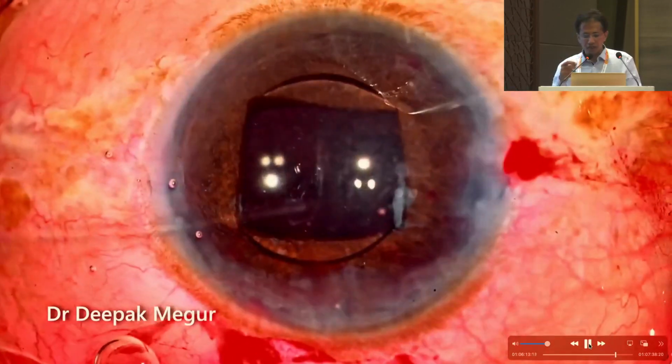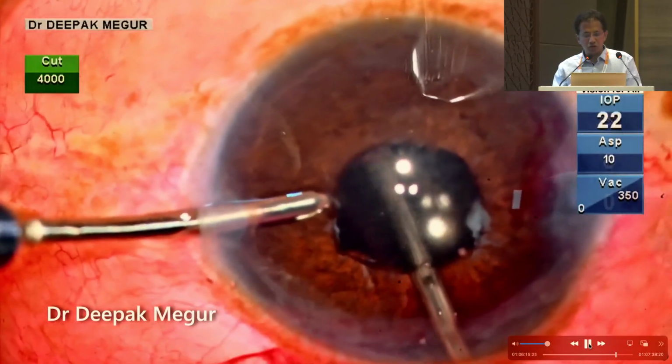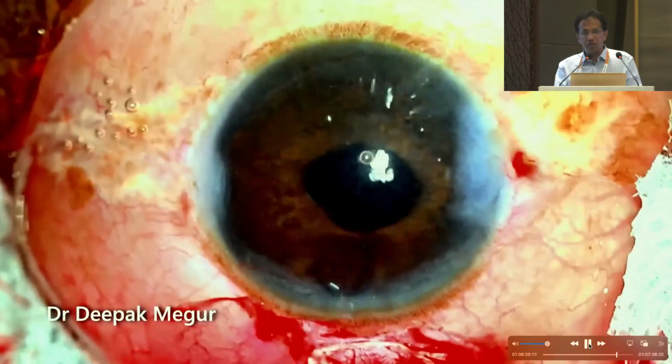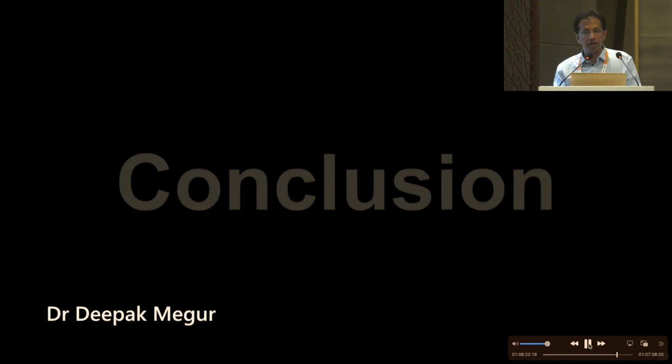So in these eyes, we want to go and remove the OVD. The eye is very soft. You can't go through the side port. So in this case, as you see, I am going through the main port itself just to clear off the OVD and some of the remaining vitreous.